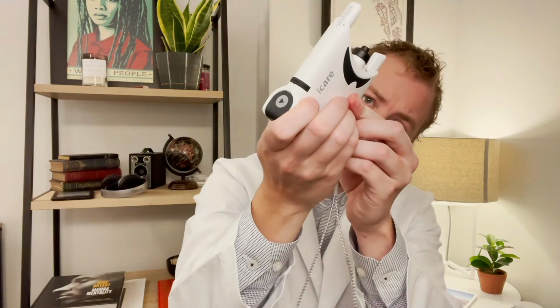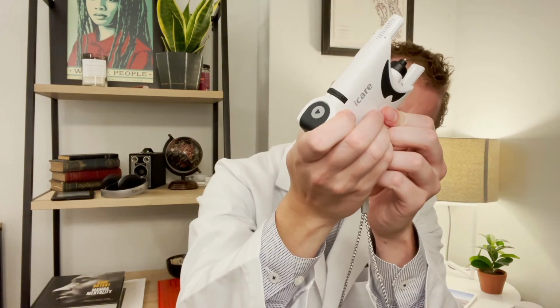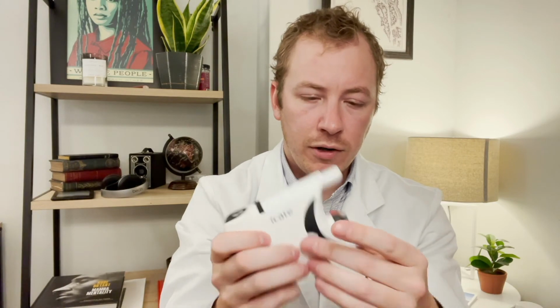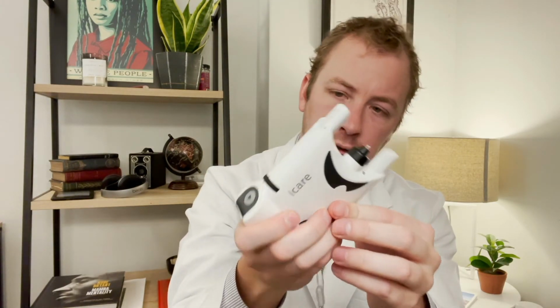So I have to get this to the right distance so that it'll fire. And then I kind of have to blink on purpose, get it all lined up. And that said too far, so we'll get a little closer. Beep, beep, beep is too far. Get a little closer. And it does depend on how hard you're pushing on your face. Keep that in mind here too. So we reset again. And then I'm gonna put my eyelash in the way on purpose. Just rested my eyelash right on there.